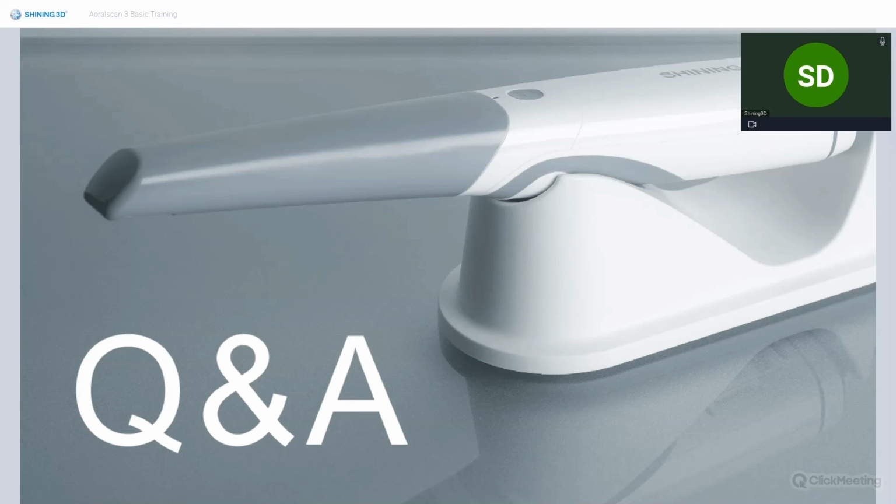Sorry, could you repeat about the orthodontic movement made by the LS3? Is it trustable for the real case? For a real case, you need to do the orthodontic movement with some professional designing software, not the orthodontic simulation built into the LS3 software.